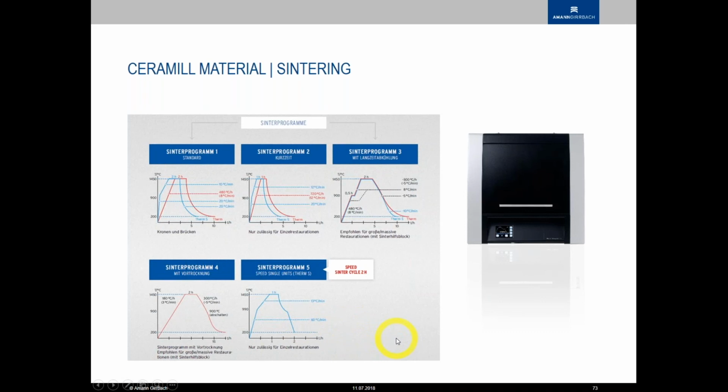And so it's glowing red when it opens up, and you have to wait for about 30 minutes before it's maybe a little higher than room temperature, 60 degrees or something, so that you can actually touch it.